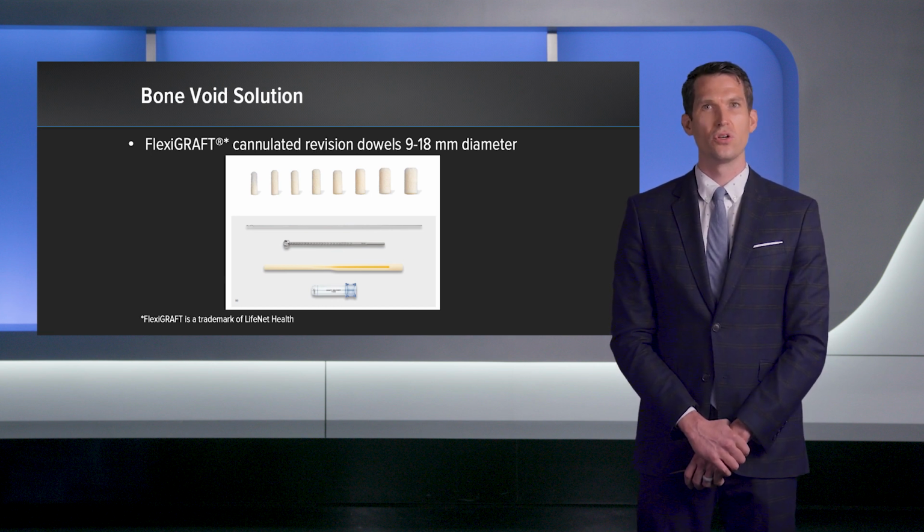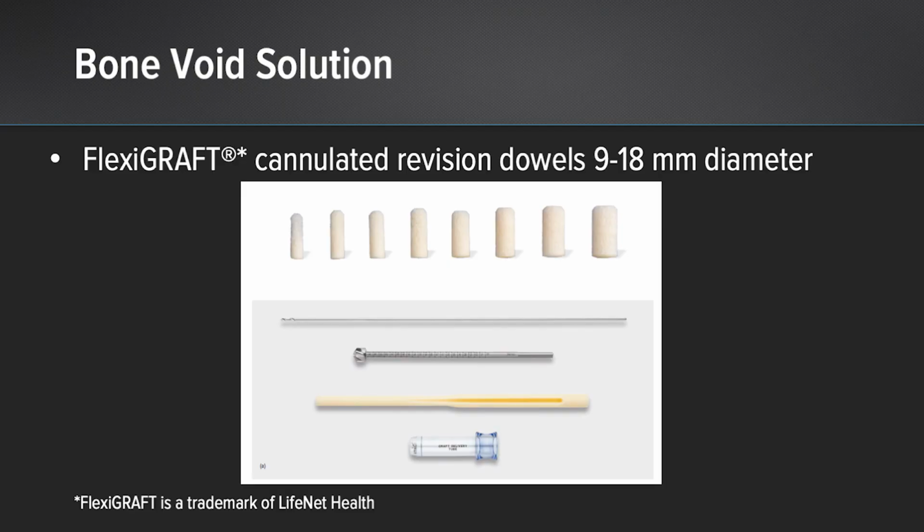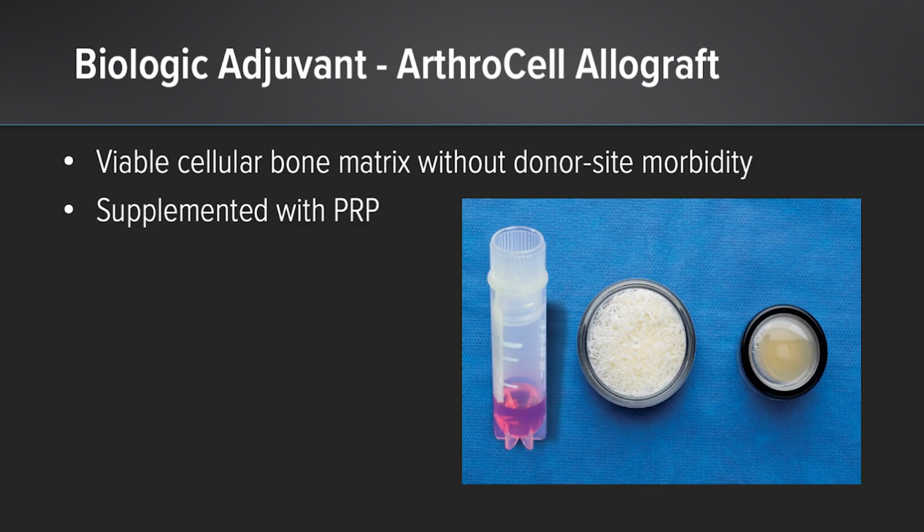This comes in different diameters, 9 millimeters to 18 millimeters, with a matching cannulated reamer to allow for preparation of the surrounding bone. We also had a biologic adjuvant available, ArthroCell, which has viable stem cells without the donor site morbidity of harvesting from sites such as the proximal tibia or the iliac crest, and we supplemented this with a PRP for cell signaling.